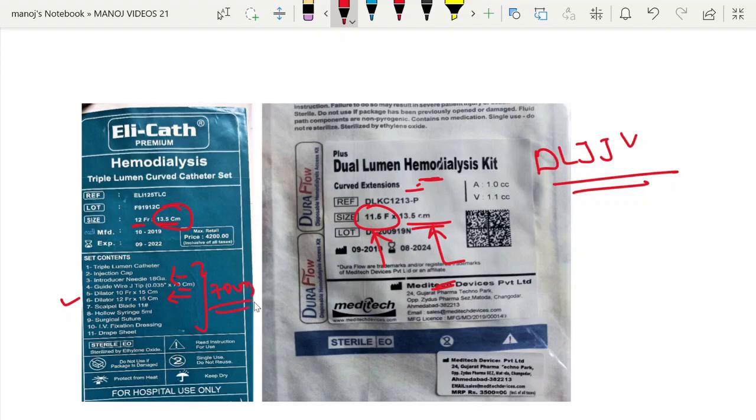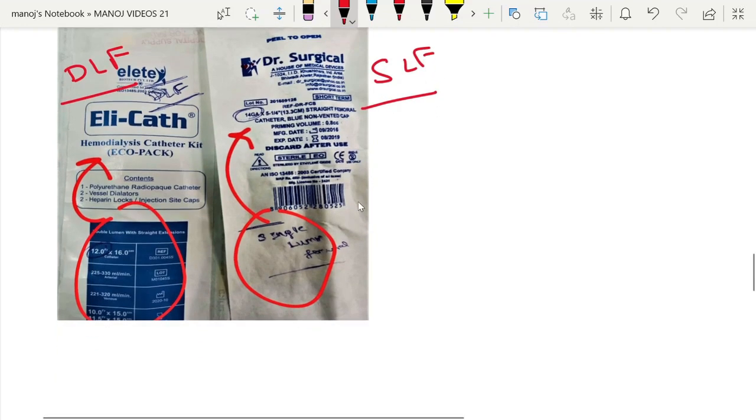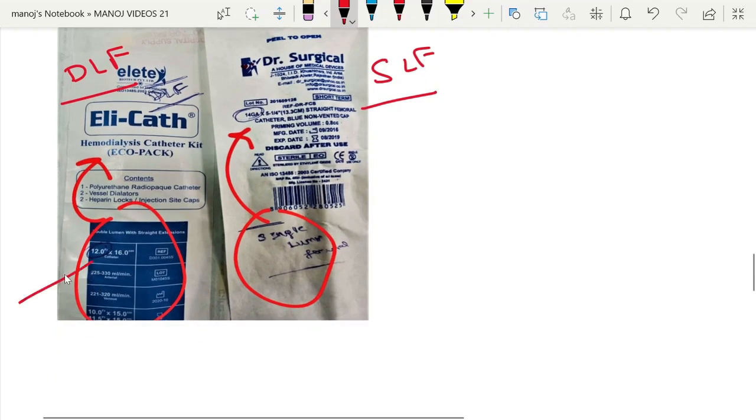This is the wrapper of double lumen femoral catheter. As we see here the size is 12 French or 16 centimeter. And here they have mentioned what will be the blood flow it can give, the blood flow up to 225 to 330 ml per minute.